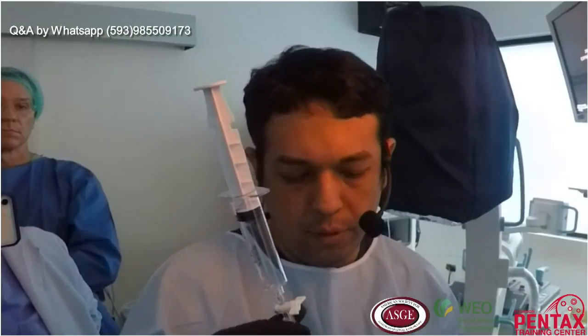Now, I am already fixed with my needle. I am in a very good position here. This is the tip of my needle, okay? And I will use bupivacaine first. Give me bupivacaine, 10 ml. This was the first EUS therapeutic.